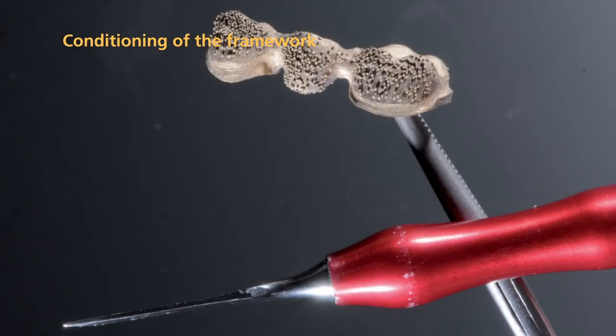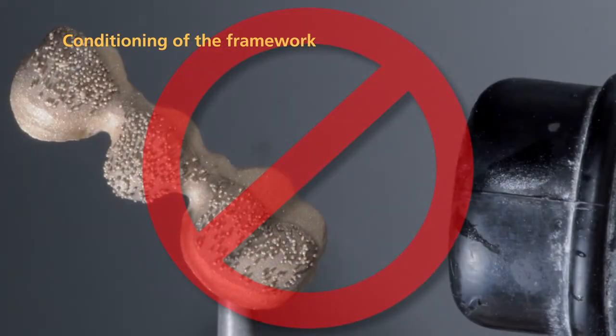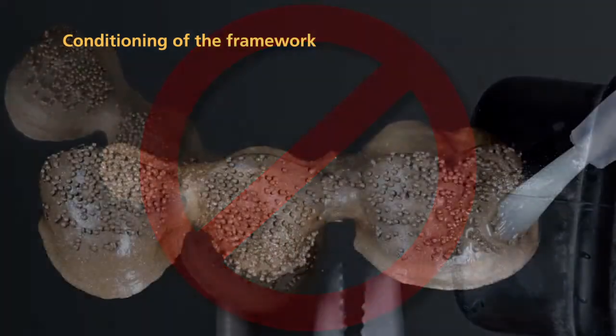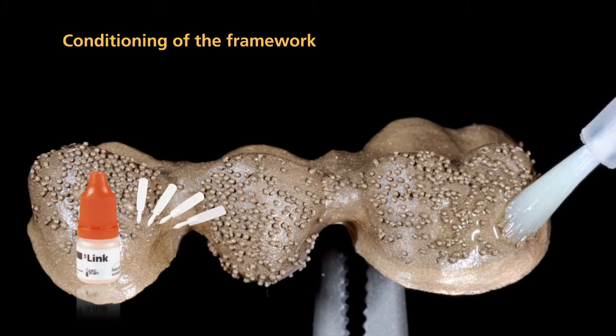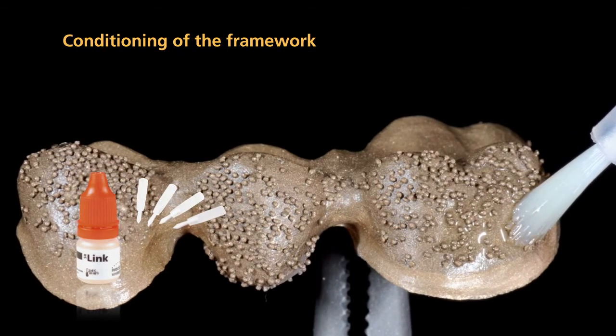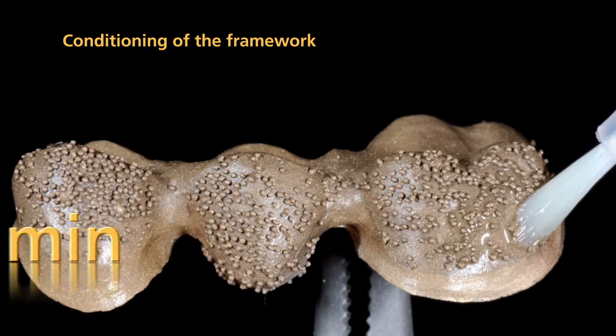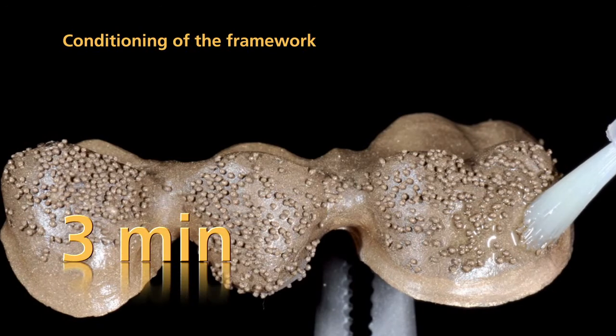After blasting, remove blasting medium residue by tapping it off with an instrument. After blasting with aluminum oxide, do not clean the framework with steam or an air gun. Immediately after having tapped off the residue, apply SR-Link bonding agent using a disposable brush. Please note that SR-Link should be allowed to react on the metal surface for 3 minutes.